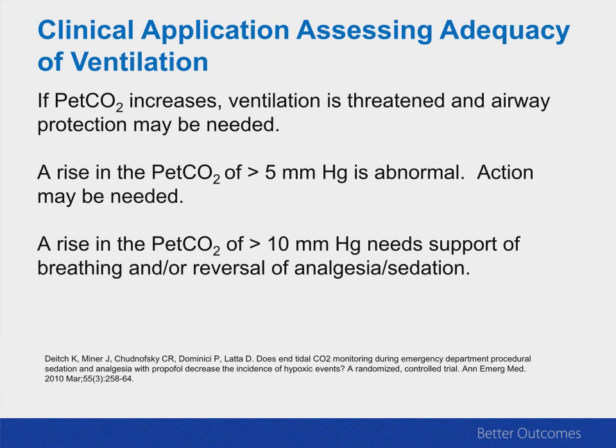Now, when we look at applying capnography to ventilation, again, it becomes very simple. Normal end tidal CO2 levels are just a few millimeters below the arterial carbon dioxide level. So if your arterial carbon dioxide level is 40, normal end tidal might be 35. So if you're at a patient's bedside and you see an end tidal carbon dioxide level increase, say even by as little as 5 millimeters, you should start to be concerned.